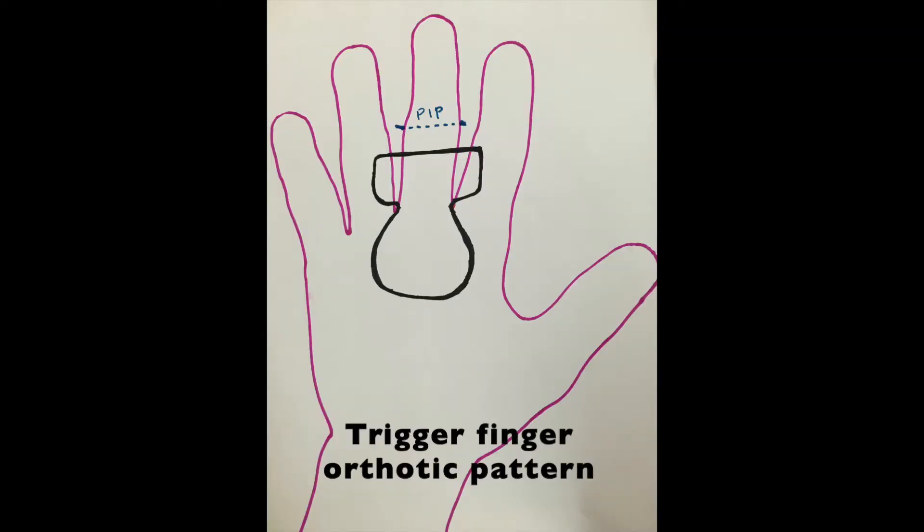Here's the splint design for the trigger finger splint. Just make sure that the top portion of the trough — the distal portion — is well below the PIP joint, because you don't want any unnecessary impingement of that joint.